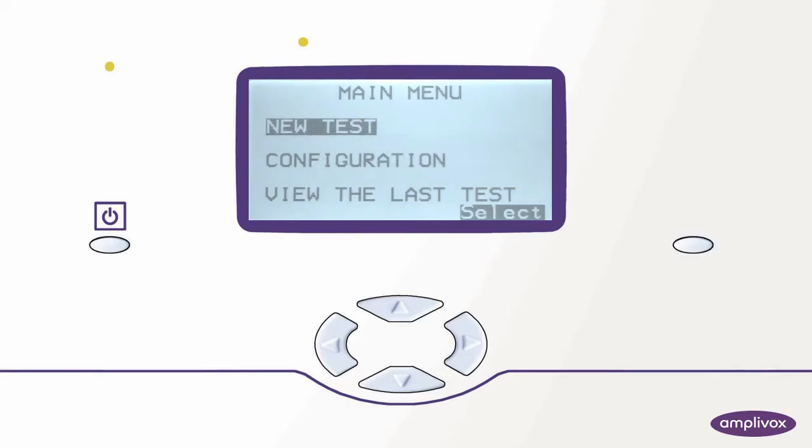Thank you for joining this fast learner video. This video will give you an overview of how to activate ipsilateral reflexes in your 302 admittance meter.